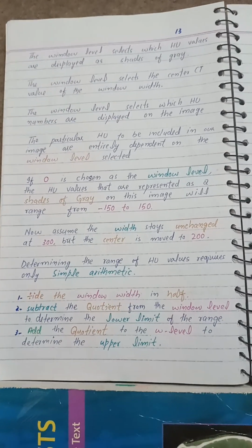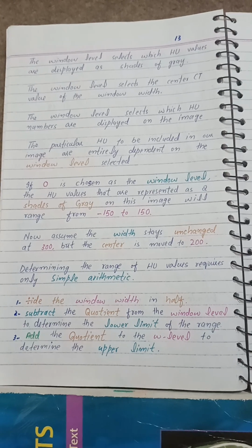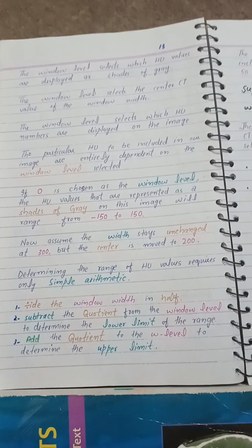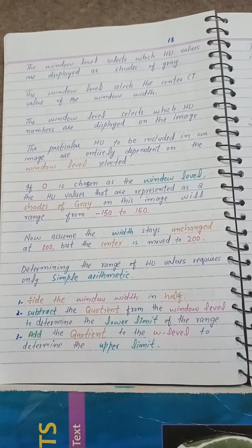If 0 is chosen as the window level, the Hounsfield unit values that are represented as shades of gray on this image will range from -150 to 150. Now assume the width stays unchanged at 300 but the center is moved to 200.